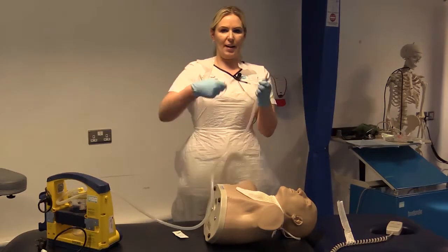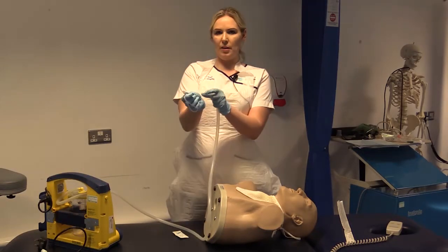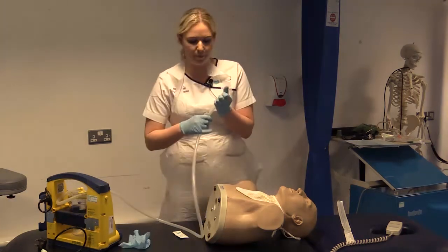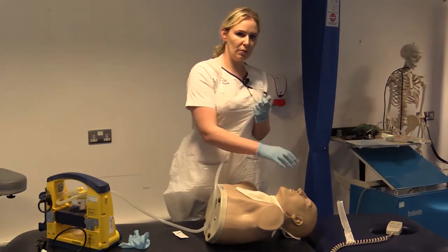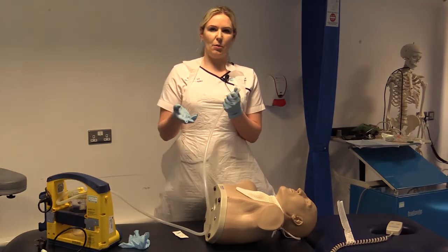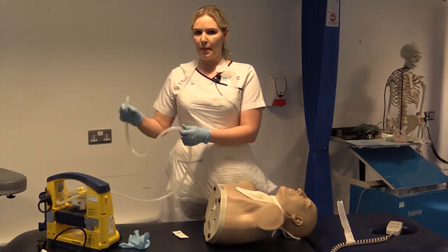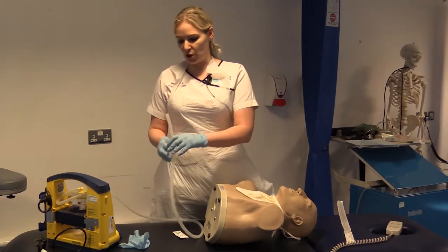And then you're going to wrap your catheter around your dominant hand, pull the lower end of your glove over your catheter, discard of that, reapply your oxygen. You're going to reassess your patient and decide whether you need to repeat your suction again. You're going to flush out your suction tubing, and then you're going to remove your PPE and wash your hands.